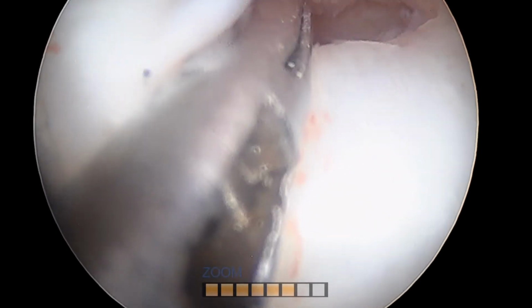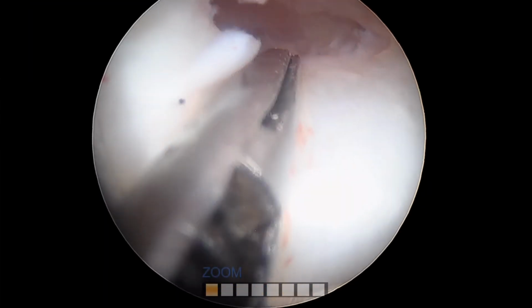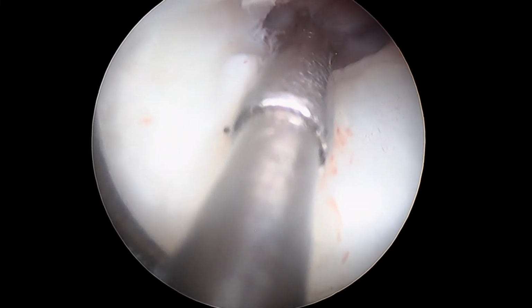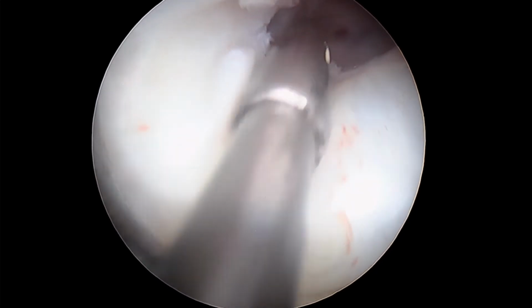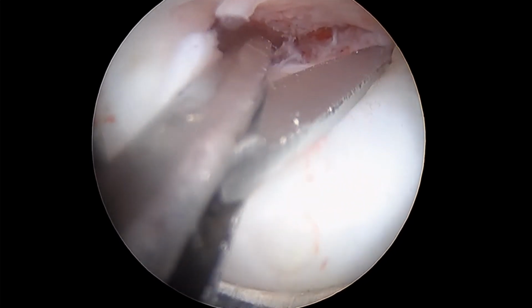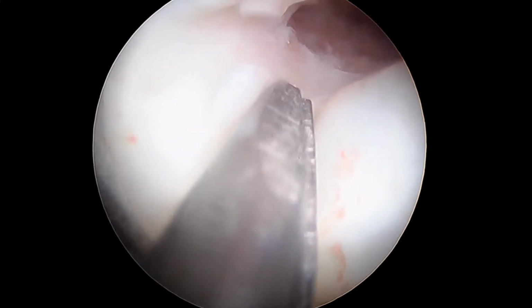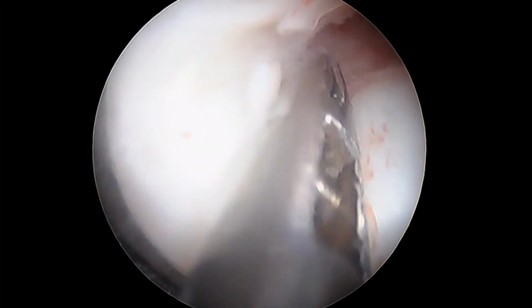It's usually much better and more comfortable to start from the periphery to the center. The distension pressures of the uterus can range between 100 to 200, and slowly you begin to create a cavity.